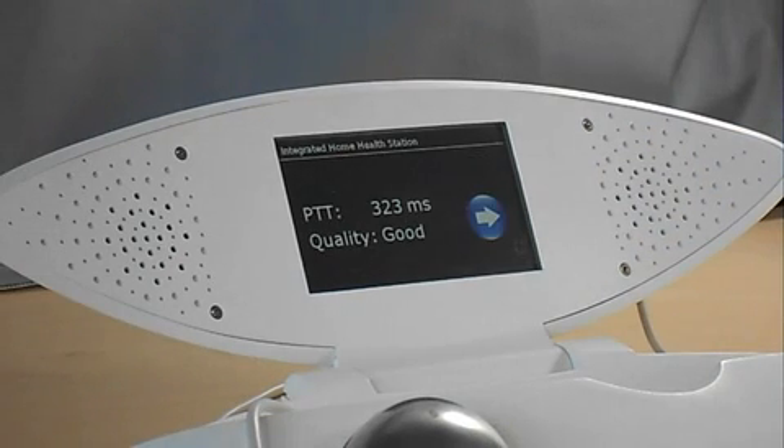The measurement has been successfully completed. Please press the blue button on the screen to proceed to the next step.